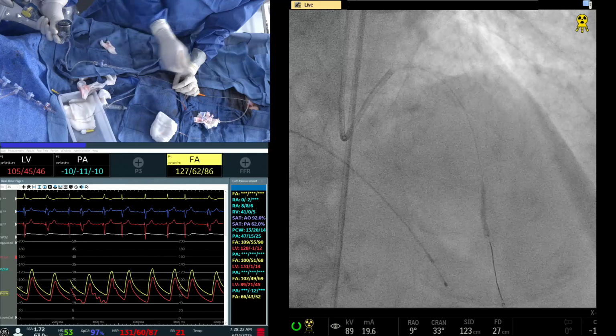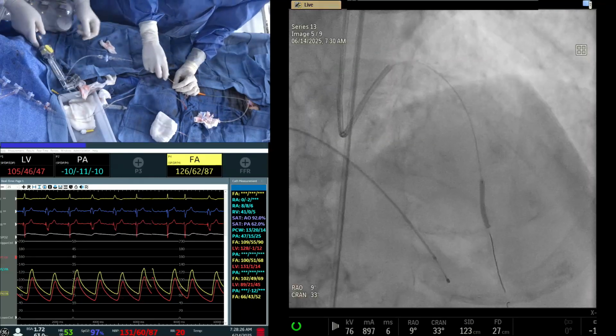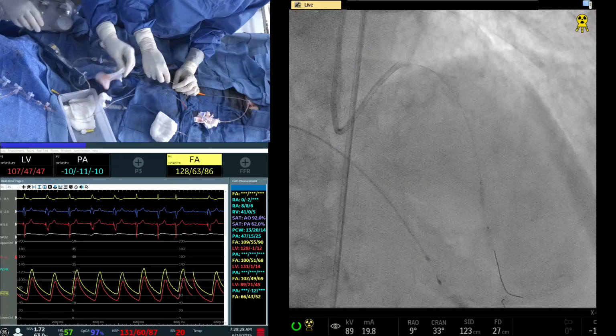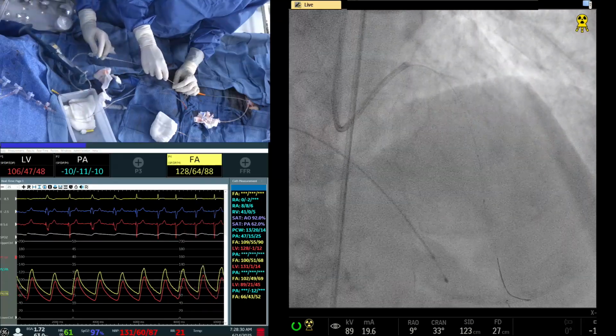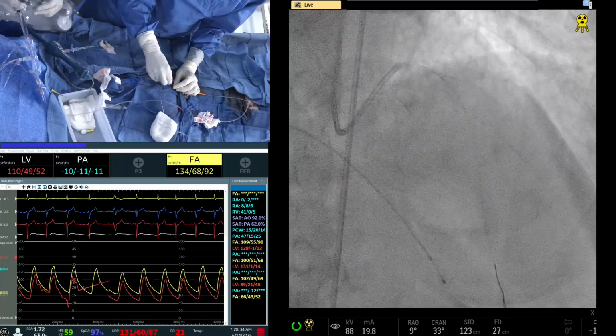It's a bridge, so you have to be very careful. Okay, down. So we have all the strategy. If you need to upgrade the bar, we can upgrade the bar. Also, we want to take a picture to see how it looks. Then decide.